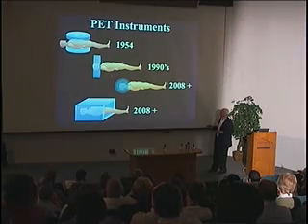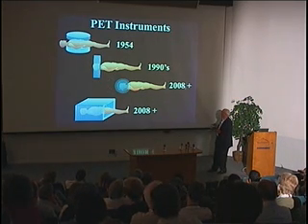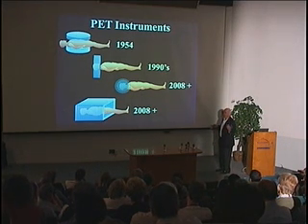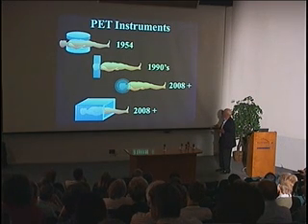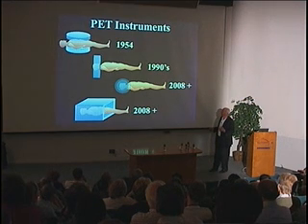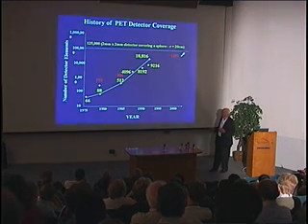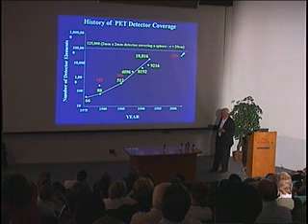So this has evolved now to multi-ring systems, and our own hopeful new system says 2008 plus. It used to say 2006 until OMB cut the medical applications budget, so I added a few years. And hopefully we'll have whole body systems that will take advantage of the isotope. So this is the evolution of improved volume. Here's where LBL stood in this evolution.